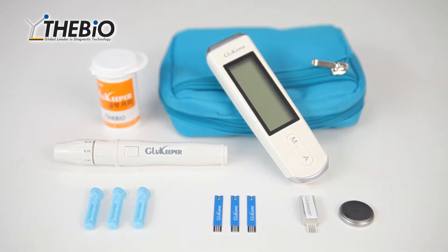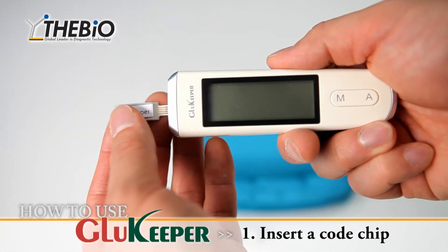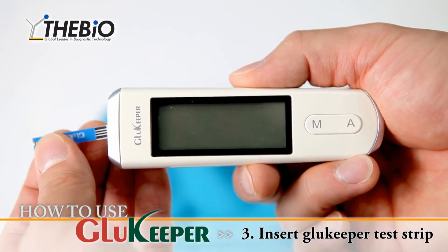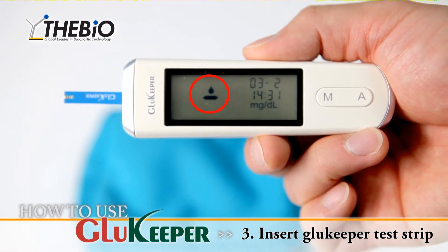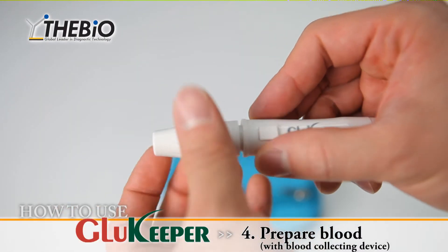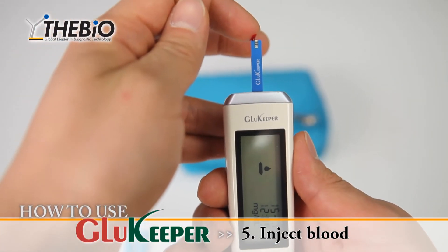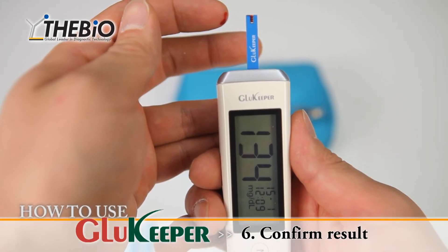Glue Keeper blood glucose measuring system is easy and simple to use. 1. Insert a code chip. 2. Confirm the code. 3. Insert Glue Keeper test strip. 4. Prepare blood and blood collecting device. 5. Inject blood. 6. Confirmed result.